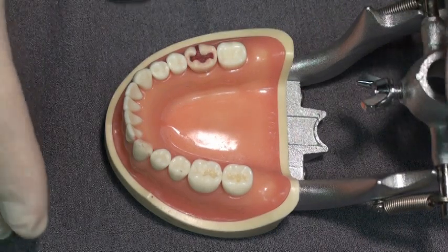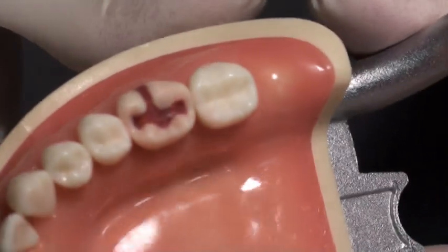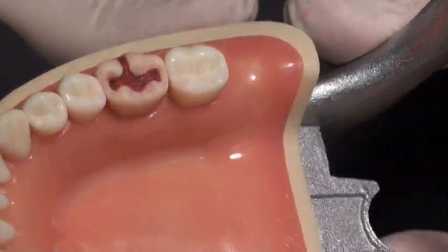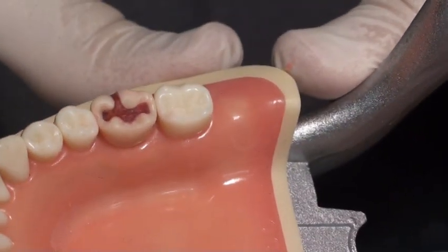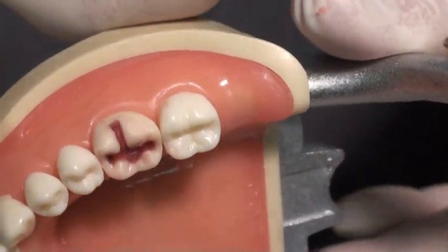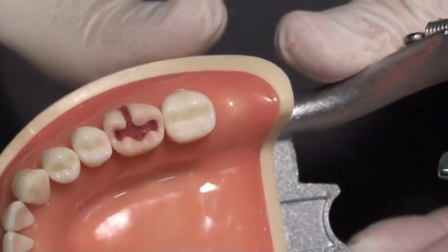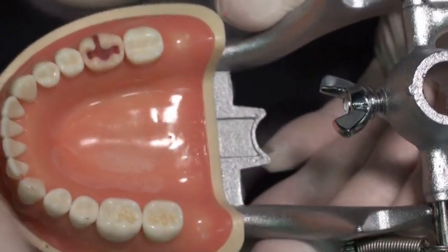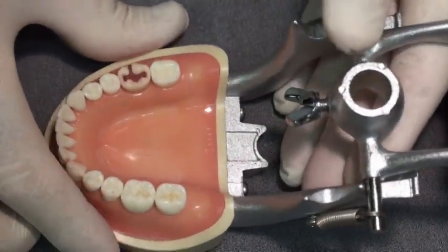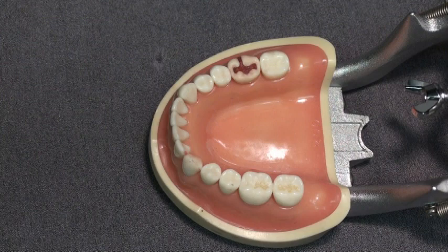I'm now going to show you how smooth this wax is. This is all done with a gloved finger, and a plastic placement instrument is used to scrape away the excess. We've already taken into account the patient's occlusion. Now we're going to take a very small impression with a clear bite registration material, which will be used later on to reform the unset composite and allow light through for curing, leaving a surface that is not air inhibited and needs no polishing.